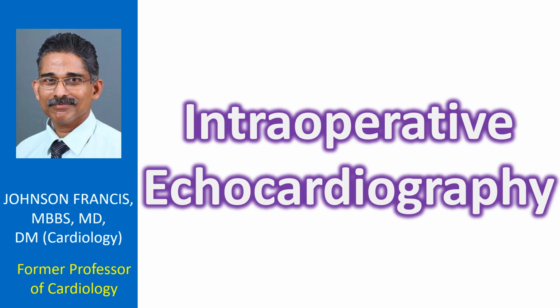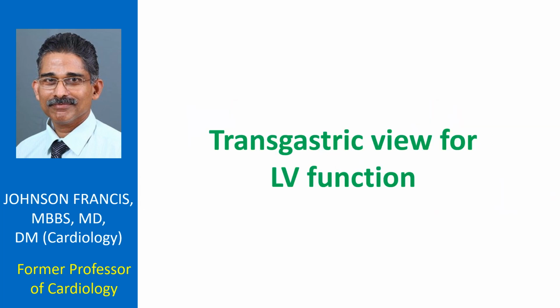The continuous intraoperative monitoring of left ventricular function is now routine in prolonged non-cardiac surgeries like liver transplantation. Transgastric view is good for left ventricular systolic function assessment. Diastolic function can be assessed by Doppler. RV function can be assessed from tricuspid annular movement.